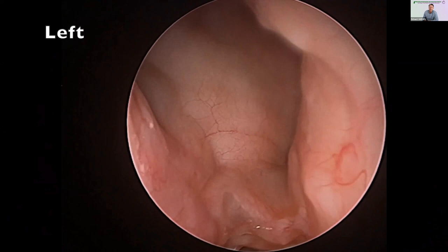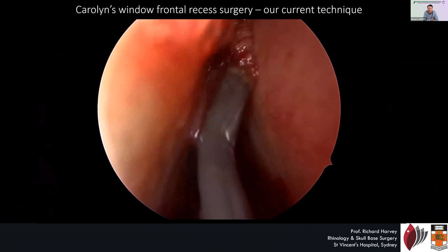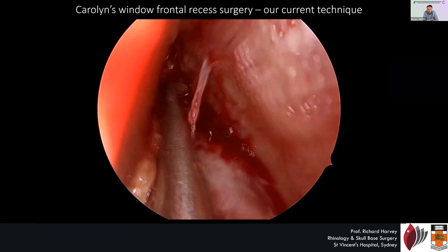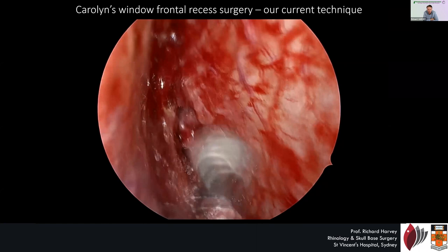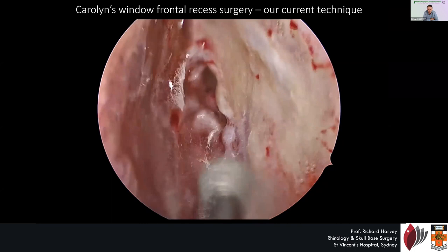These sinus cavities heal really nicely. When you look up now, sometimes you get a small adhesion, but you get this really nice giant look up into the frontal sinus with just a zero degree. Someone said to me — Richard, so you're doing this for complicated surgery or tumors. That's not correct. This is our standard frontal sinus surgery technique now. We don't spend a lot of time doing angled instrumentation. We remove the axilla and the anterior-to-posterior beak in every case where we think we have to do frontal recess surgery.